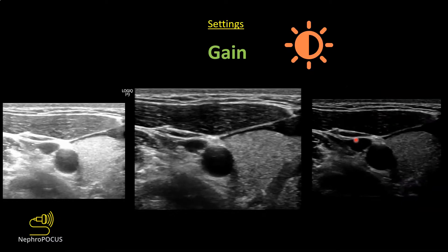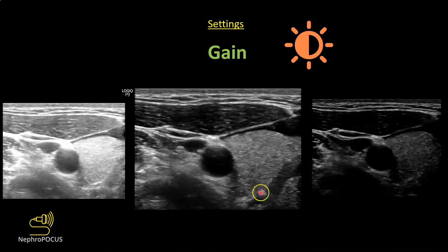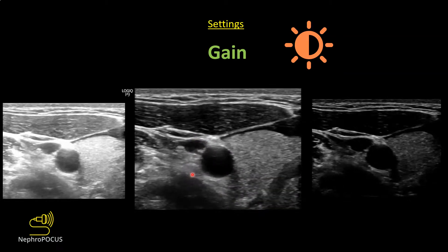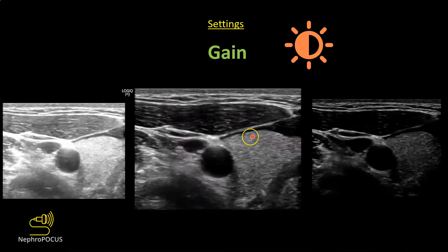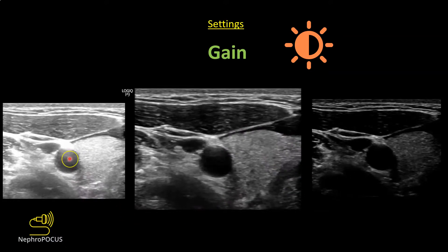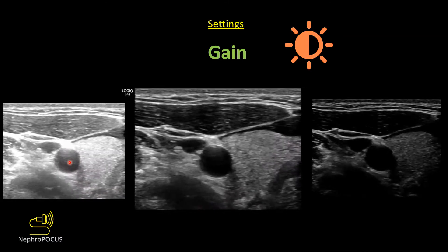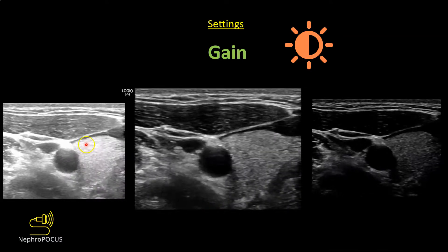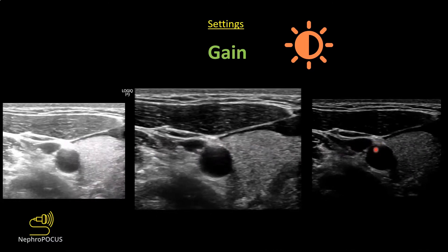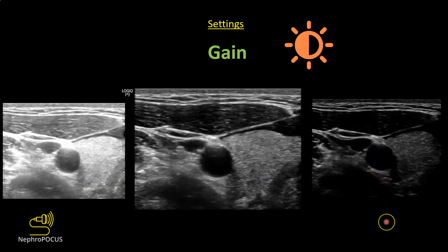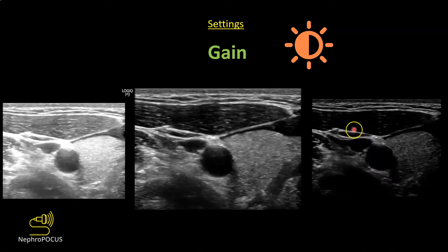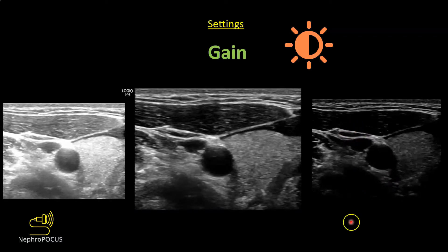Gain is simply the brightness of the ultrasound image. An image with optimal gain allows you to appreciate all structures clearly, such as a carotid artery, jugular vein, and thyroid gland with homogeneous echo texture. An over-gained image is too bright and makes it easy to miss structures like nerves, which is especially important during procedures. An under-gained image is too dark — important structures may be missed; for example, a muscle may appear so dark it could be mistaken for a blood vessel.